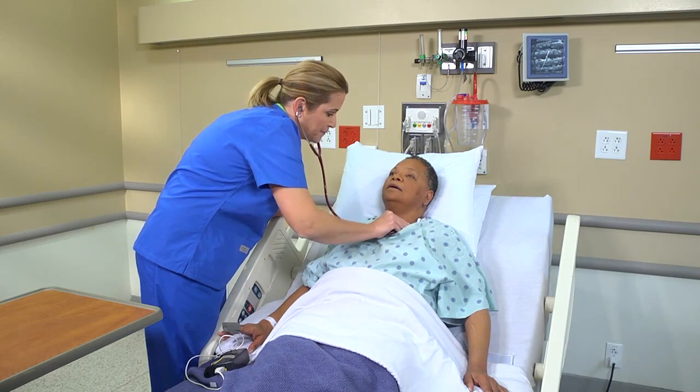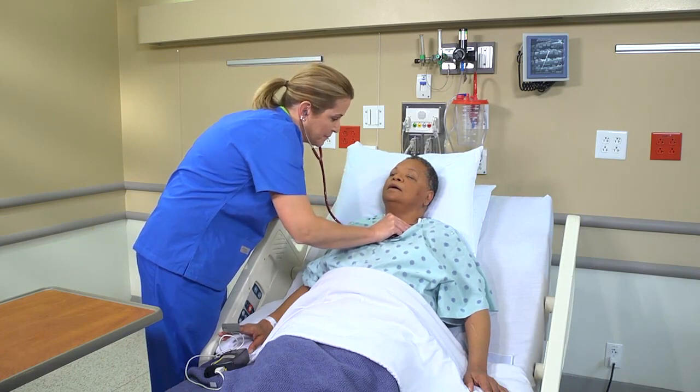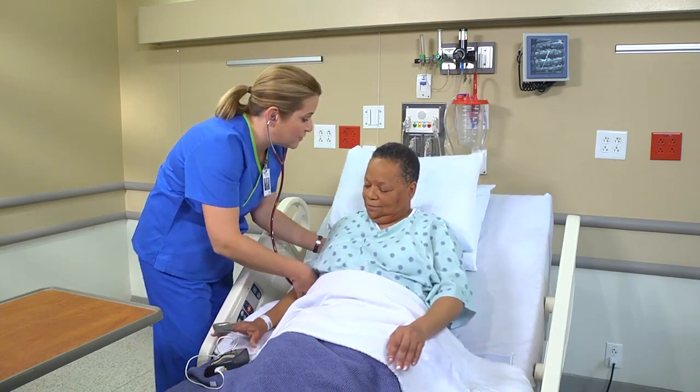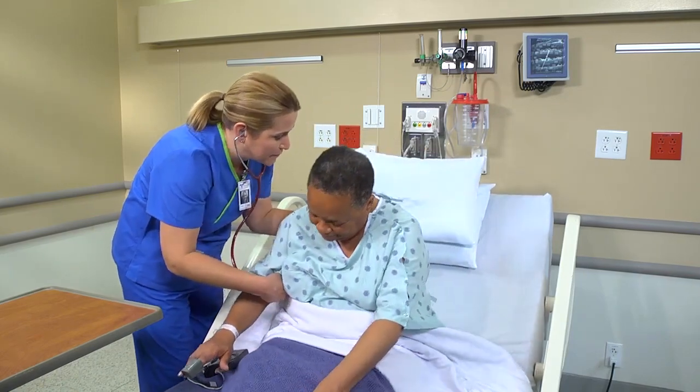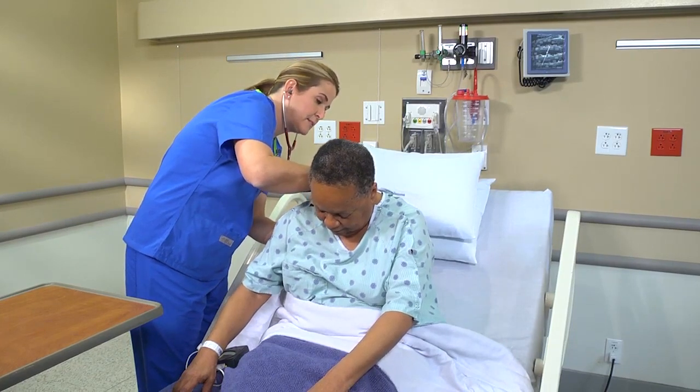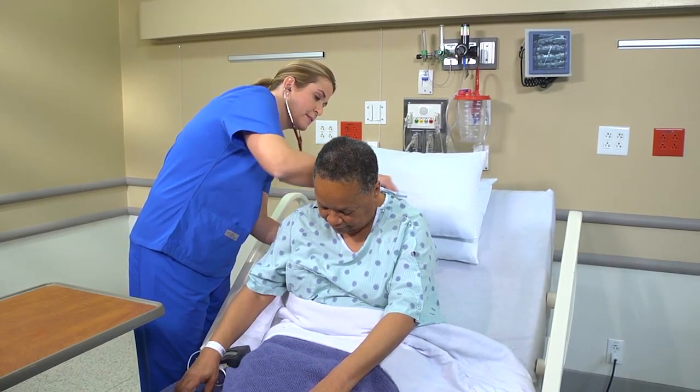Maintaining a patient's airway begins with good respiratory assessment. Ask the patient if she's having any trouble breathing or any symptoms of hypoxia, such as dizziness, unusual fatigue, or anxiety. You'll choose a non-invasive intervention to help maintain her airway based on her needs.